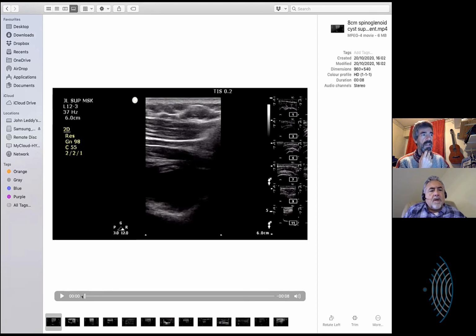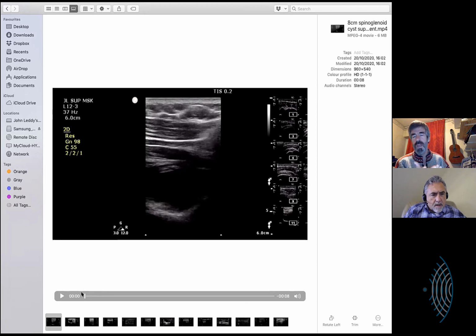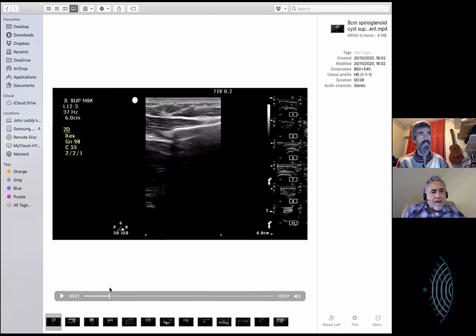Yes. Yeah. And this is what I saw. Just this bit here, just that picture there. And it just didn't look... Can you see where my arrow is? Yes. Yeah. So that's it. And it just caught my eye. That's darker than it should be. Yeah. So that's all. And I went through it and I couldn't really see it. This is on a probe place. I do a list where they haven't got a proper MSK probe, so I'm just using a vascular probe. So the picture quality is not amazing.